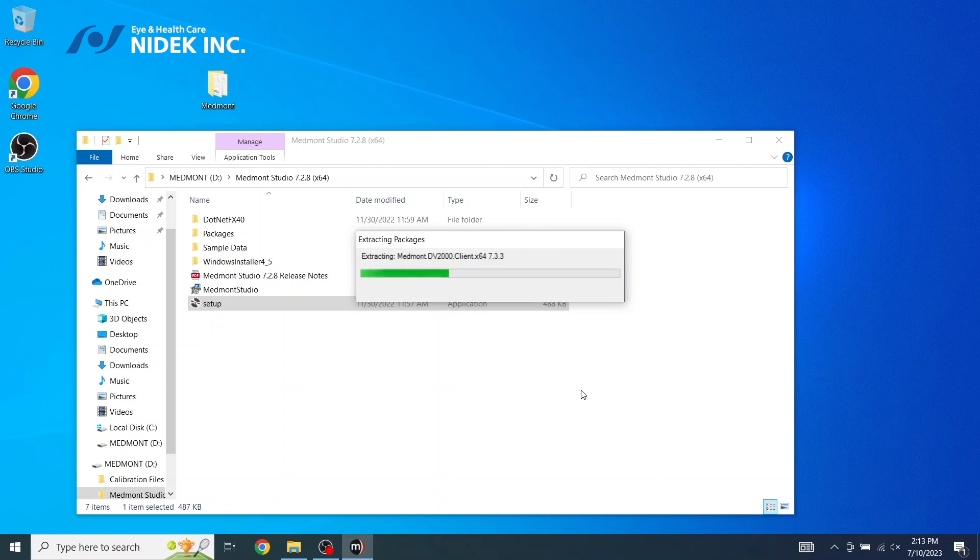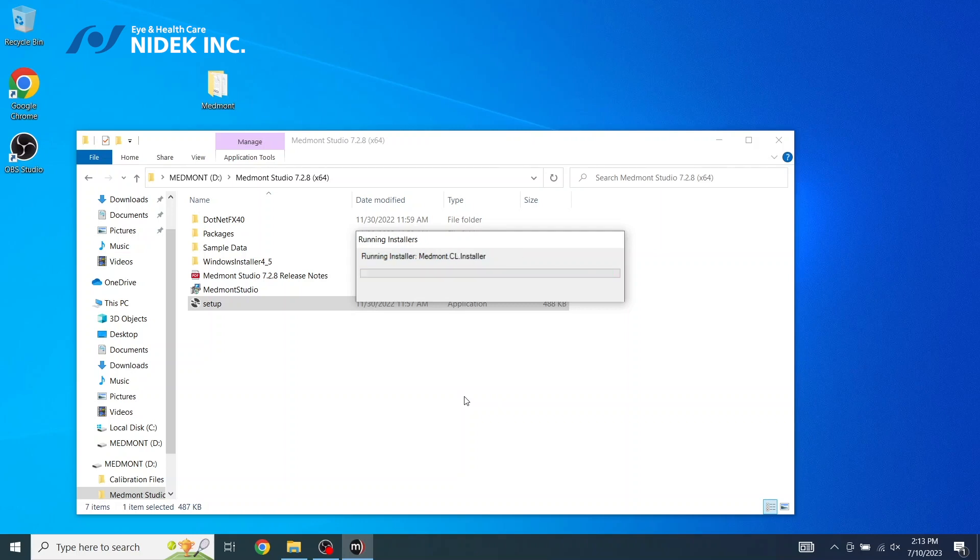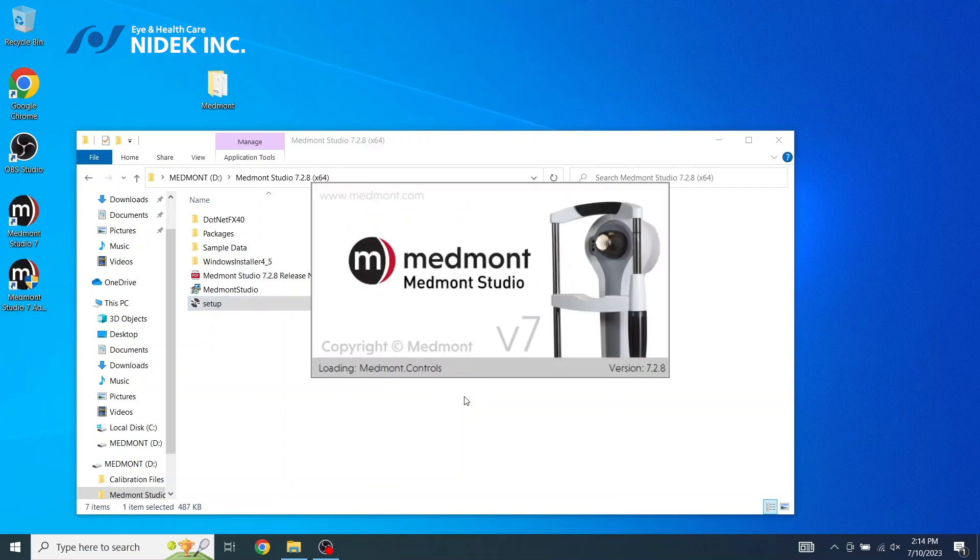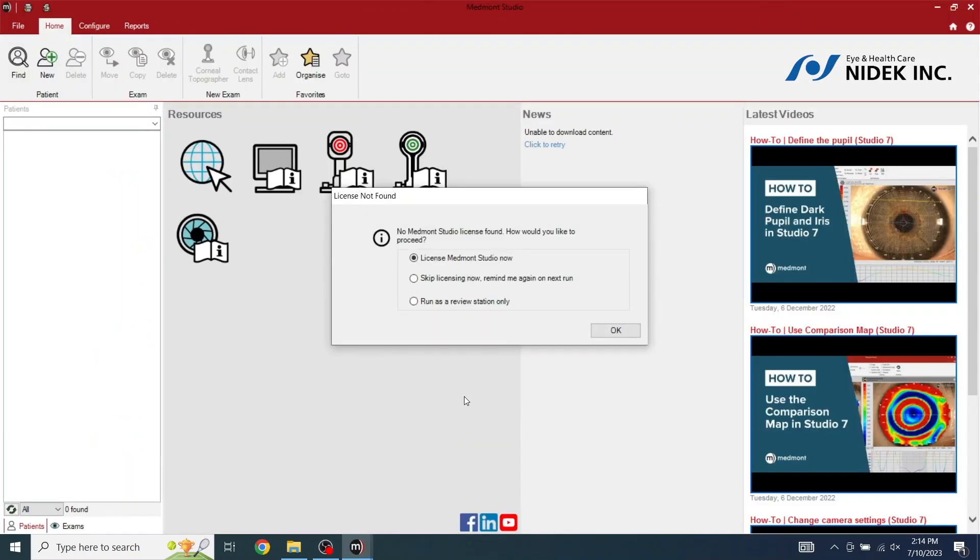This may take several seconds to install and extract. Medmont Studio is now started. The Medmont Studio license needs to be installed.